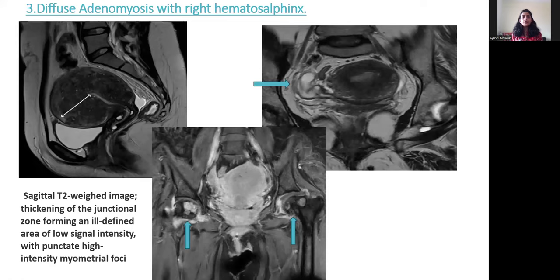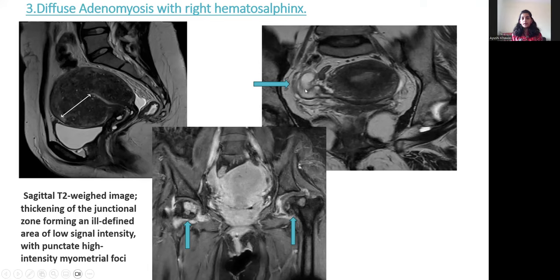Third case: diffuse adenomyosis with right hematosalpinx. Sagittal T2-weighted MRI shows thickening of the junctional zone, forming an ill-defined area of low signal intensity with punctate high-intensity myometrial foci in the anterior wall of the uterus. In the same patient, there is T1 and T2 hyperintensity in the tube-like structure on the right side, consistent with right hematosalpinx. Incidental finding is bilateral avascular necrosis of the hip joint.